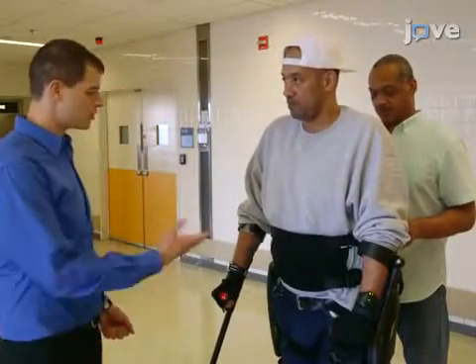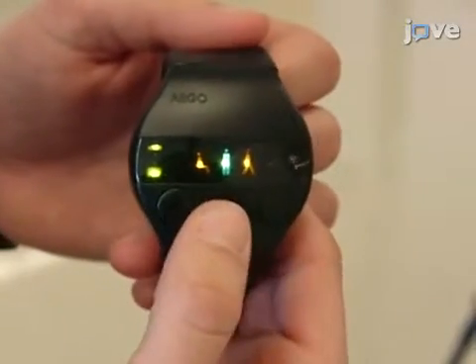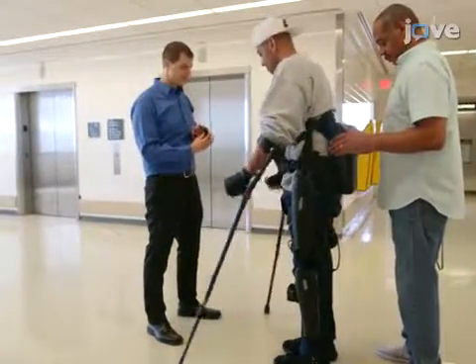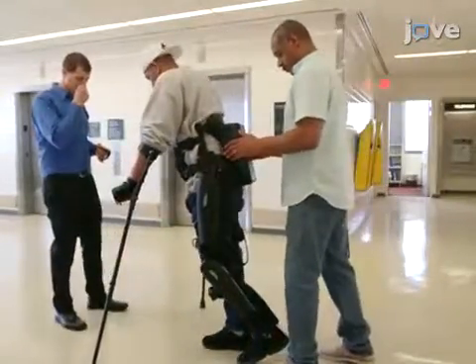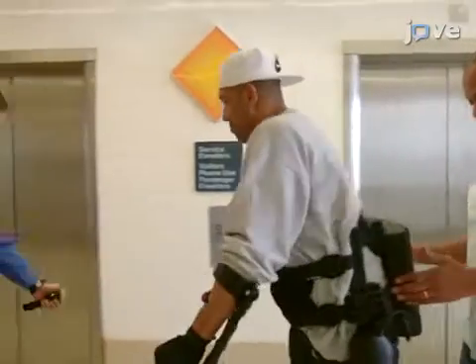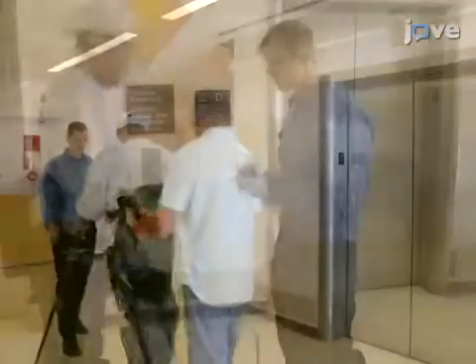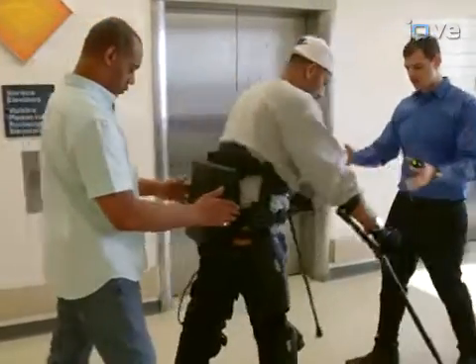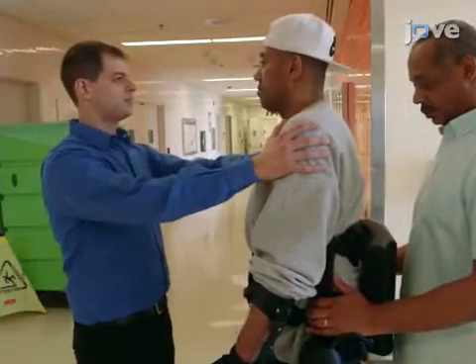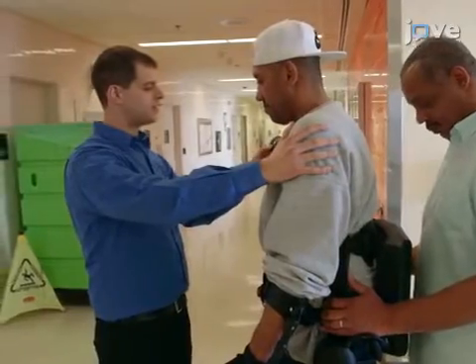Begin by instructing the participant in the mechanism of walking with the powered exoskeleton. Use the controller to select walk mode and ask the participant to shift slightly forward toward a predetermined target in order to initiate forward swing of the right leg. Instruct the user to move their crutches forward while simultaneously shifting their weight forward and to the right to maintain balance while stepping onto the right foot and unweighting the left foot. The device will sense the participant's movement and initiate forward swinging of the left leg. If needed, spot the user by grasping the powered exoskeleton or providing assistance in an area of intact sensation, such as the shoulder area.